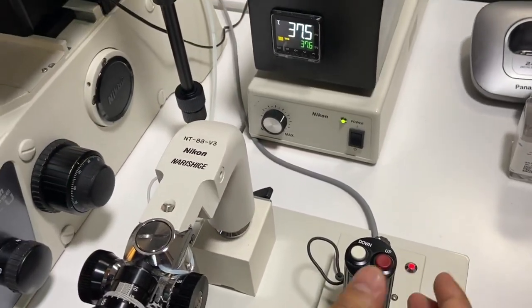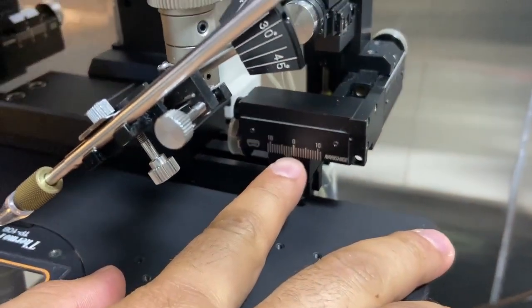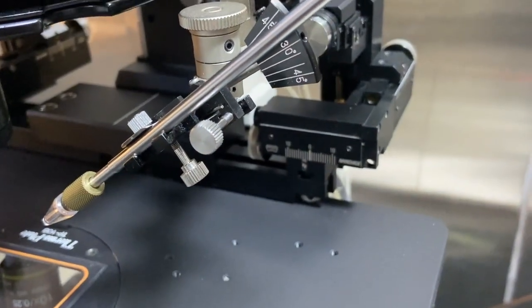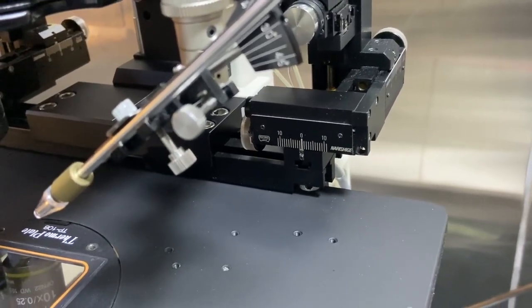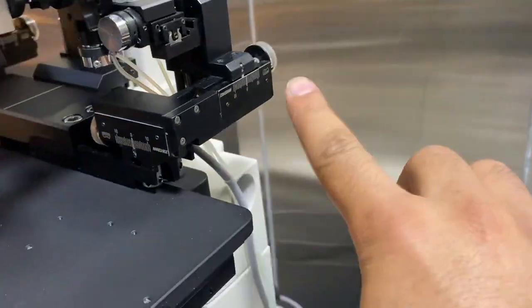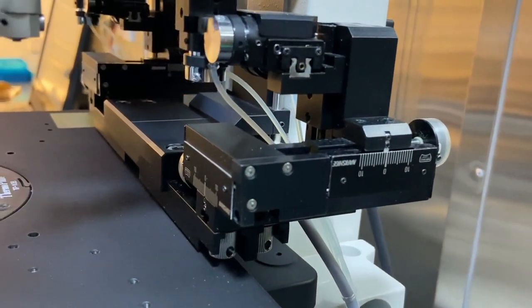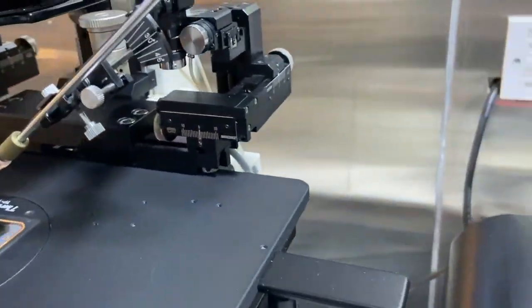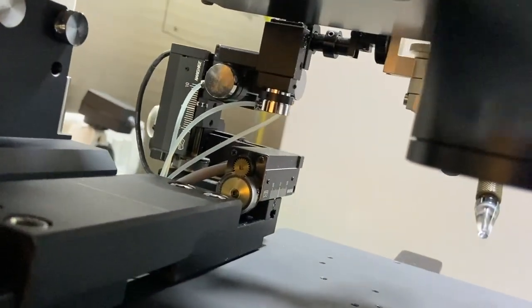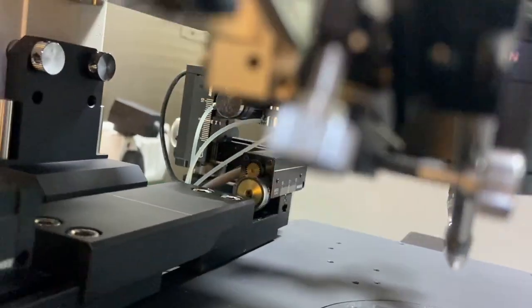Going on to the axes I was talking about, we have the x and y axis. You see this point and the 0. Everything should be on the 0, so I will slowly move it towards the 0 direction. Now this axis is aligned. Similarly, this is a little bit towards my side, so I will move it towards 0. That means this side is also 0. Now the other axis, the y axis. It is also a little on the top, so I will get it down towards the 0. Now this is all set.